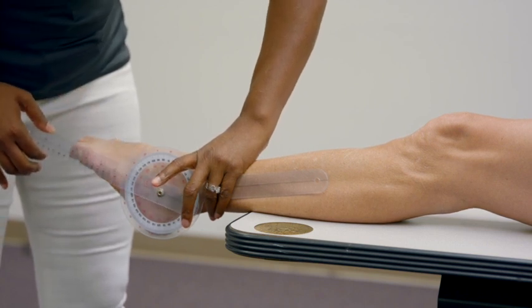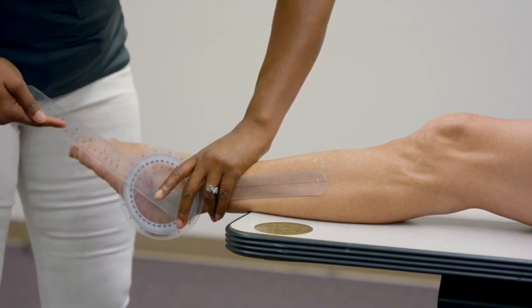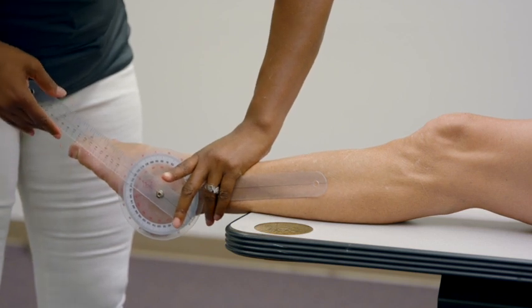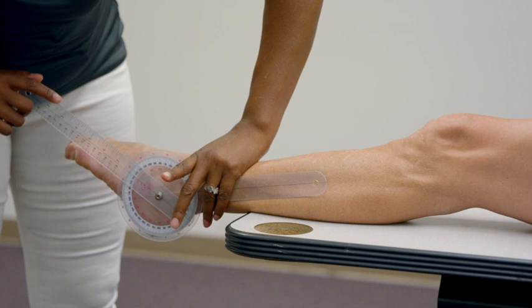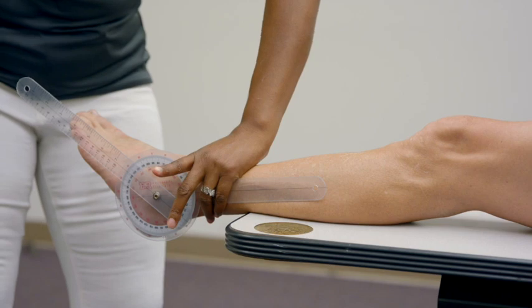You'll be tempted to take the goniometer all the way down, but remember you want this black line to be very parallel to the fifth metatarsal. Start again at 90 degrees and have the patient flex. Suze has approximately 48 degrees of plantarflexion range of motion. The normal range of motion for plantarflexion is 40 to 50 degrees, so she's not lacking.